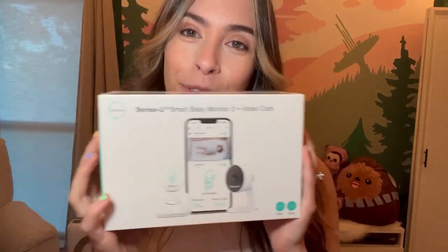Today I'm going to be reviewing the SenseU Smart Baby Monitor 3 and video camera. This baby monitor is one of the only baby monitors on the market that is able to measure in real time the baby's breathing movements, their temperature, and if they've rolled over. I'm really excited to have this because Naomi has been showing signs that she might roll over any day now, so I've been a little nervous. I can't wait to review it and tell you what I think.